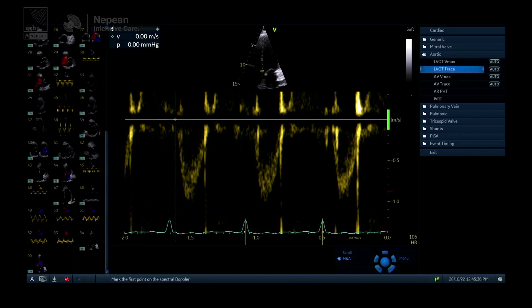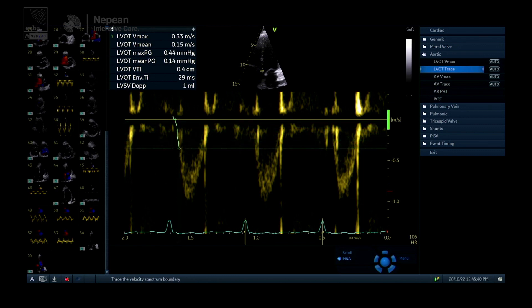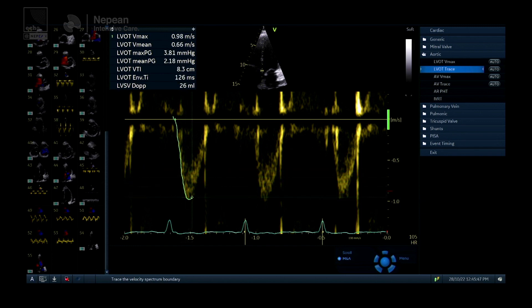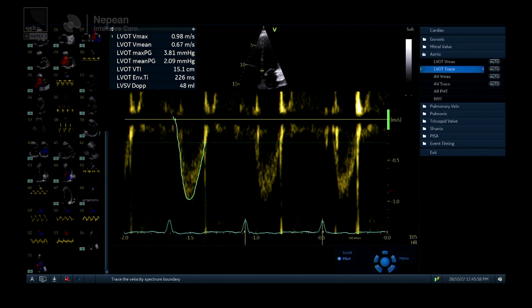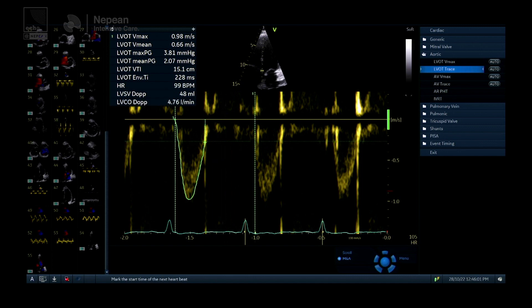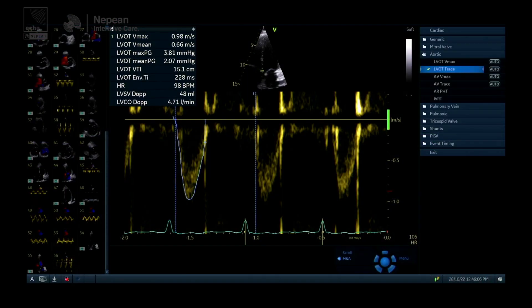It's really important to trace the modal velocity — the mean velocity of red cells going through — so you want to trace along the mid-part of that bright line. You can see the spectral profile is dark in the center with a bright outer line. If you're getting spectral broadening — turbulent flow — it can be quite difficult to trace the modal velocity accurately. Also, the wall filter could be slightly reduced so we're not missing low velocities close to the baseline, improving the accuracy of the tracing.